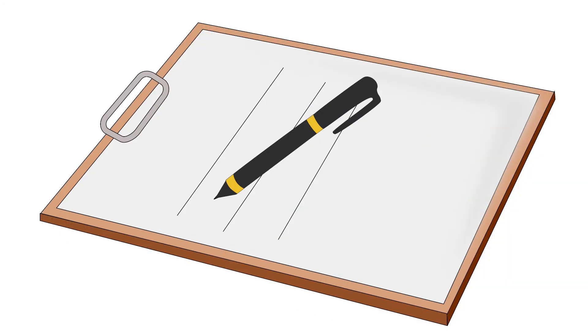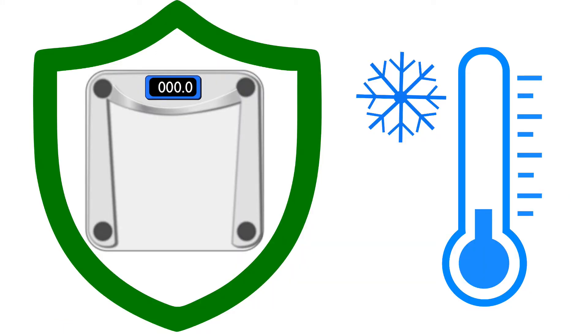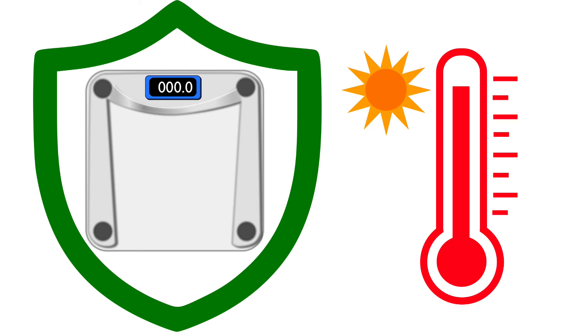Write down the weight immediately so you don't forget it. Handle the scale with care and protect it from excess humidity or excess heat.